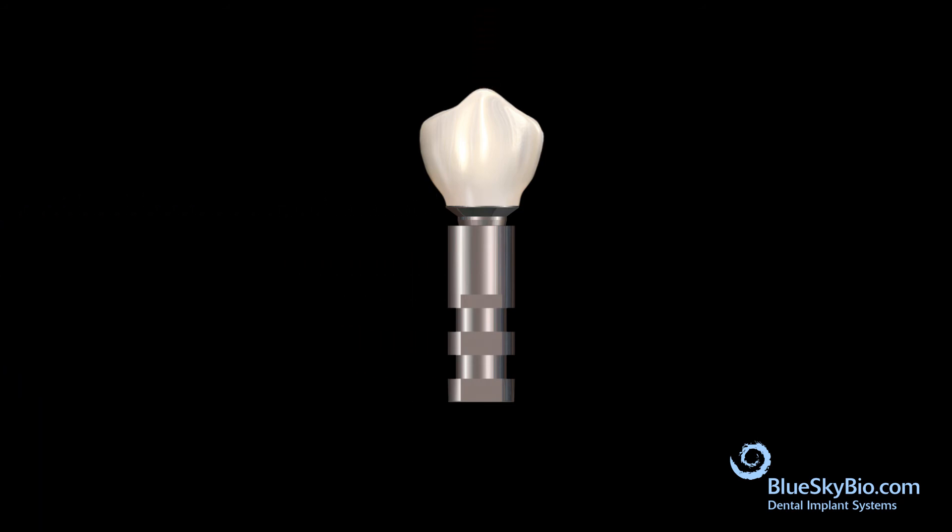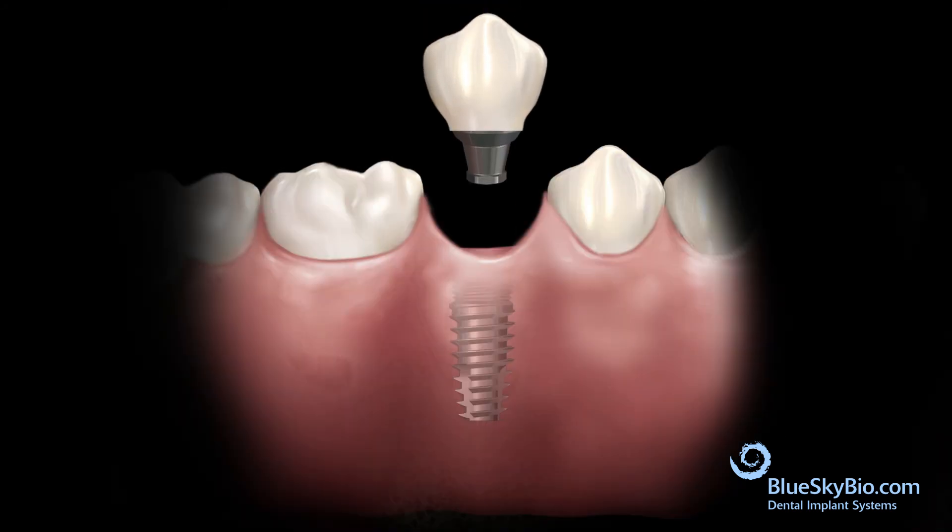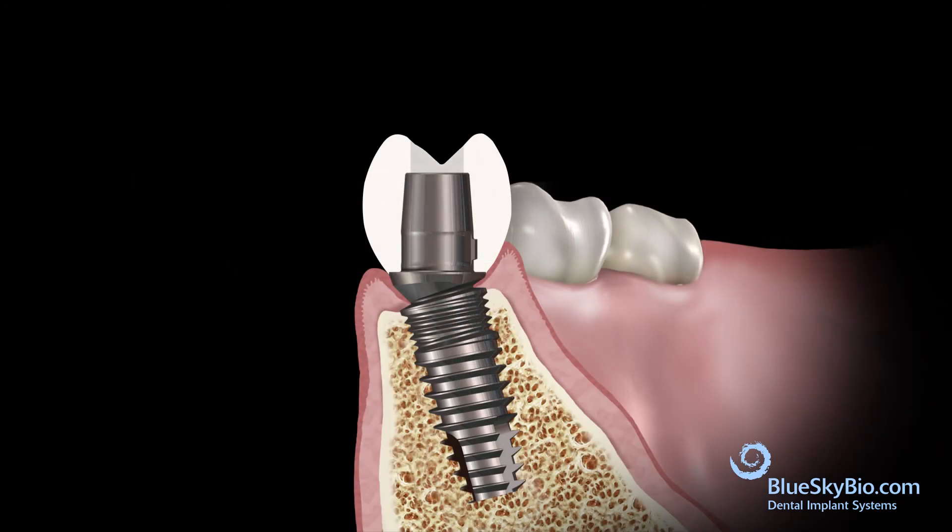Remove the crown and abutment from the analog. The restoration is seated and the screw is tightened and torqued to 30 Ncm with the ball tip screwdriver.